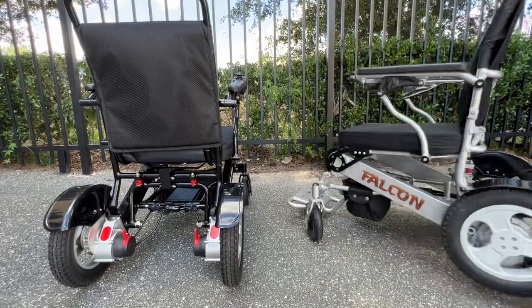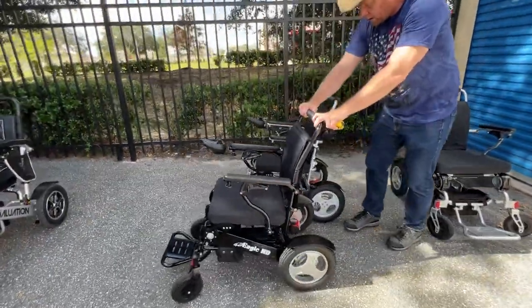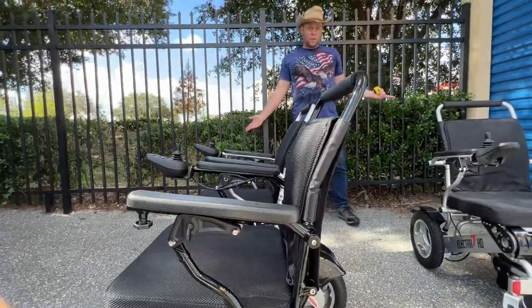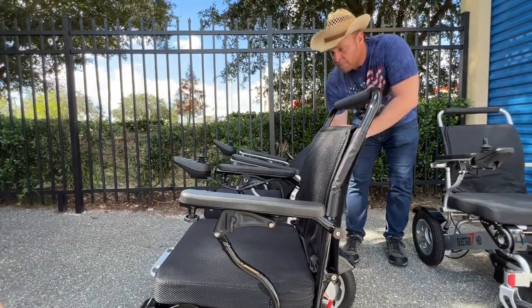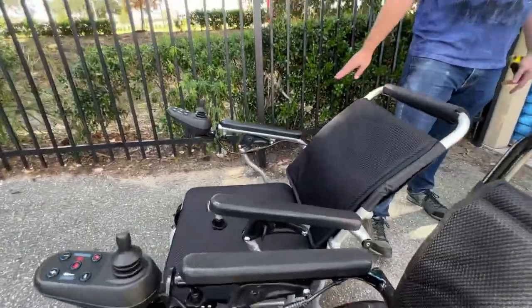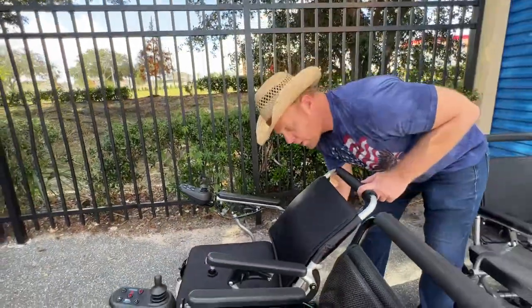Let's look at them side by side. I'll put the Eagle in front of the Falcon. You can see the Eagle is upright and the Falcon is upright — they're just the same. Now if we recline the Falcon all the way, you can see the difference. The armrest lifts on this chair when the chair actually reclines, so that's an ergonomic design. People really like that.